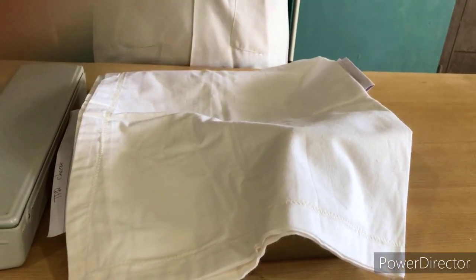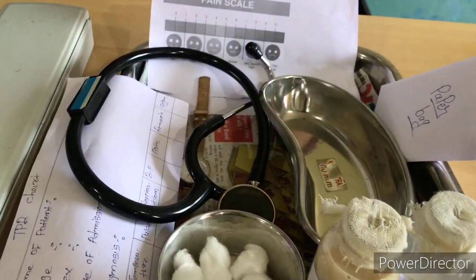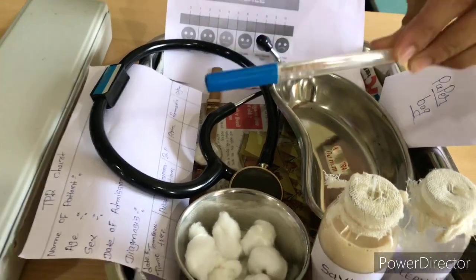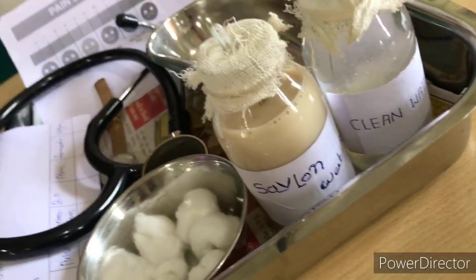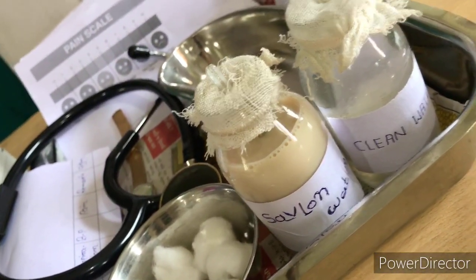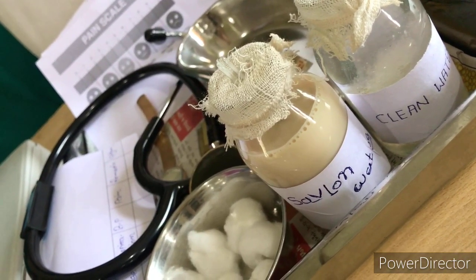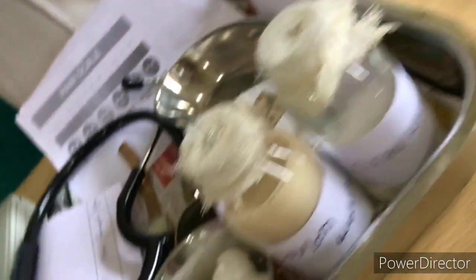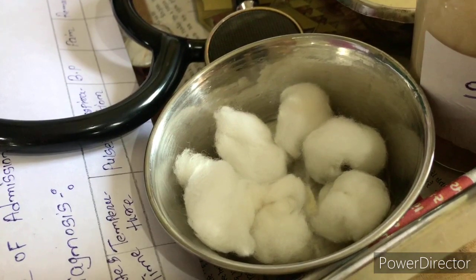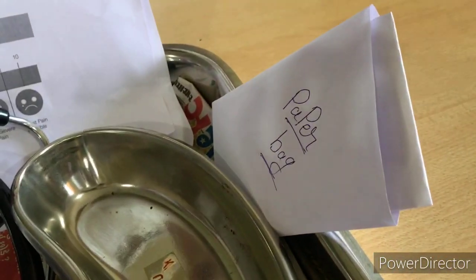Preparation of articles — tray and containers. Articles include: a thermometer to measure body temperature; Savlon solution at 1:40 ratio; antiseptic solution; cotton at the bottom of the jar to prevent breakage of the thermometer bulb; clean water to rinse the thermometer; a cotton swab with bowl to wipe the thermometer; a kidney tray to discard wet waste; and a paper bag to discard dry waste.